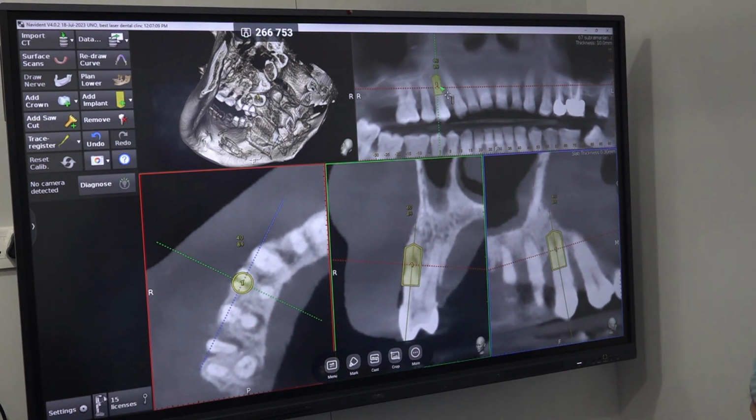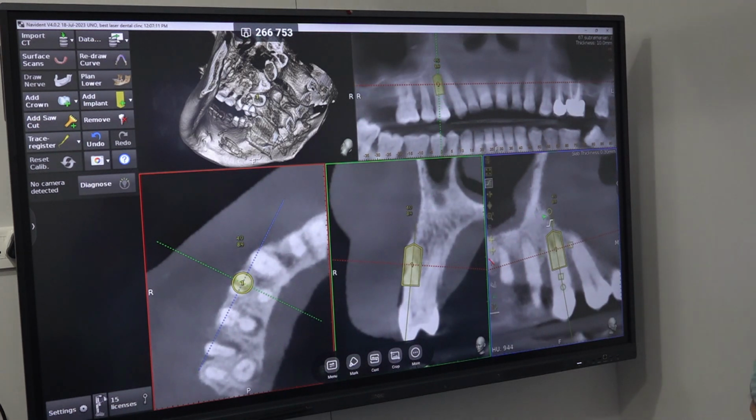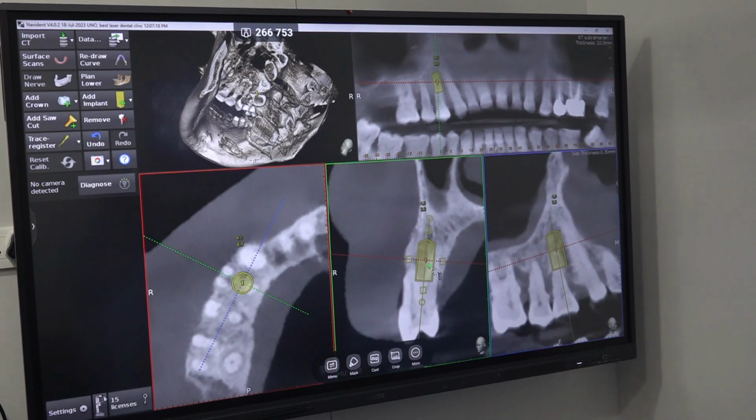Oh yes, that means the premolar has got three roots, right? Buccally two roots, and it will come. Only when two roots are present, one will be buccal and one will be palatal. So when we see buccally two roots, definitely there will be a third palatal root.